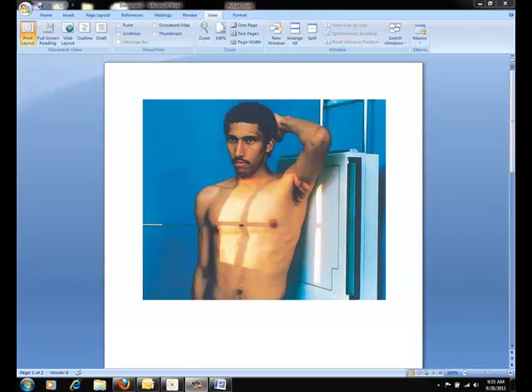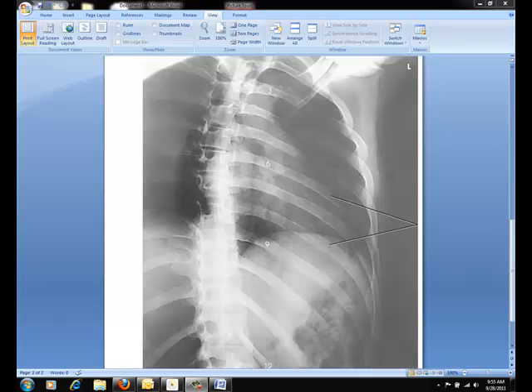As far as image evaluation goes, if you're imaging above the diaphragm, you should be able to visualize the 1st through the 10th ribs. If you're doing below the diaphragm, the 8th through 12th ribs should be visible. You should also be able to visibly see ribs through the lungs or the abdomen, depending on the region that you are examining.